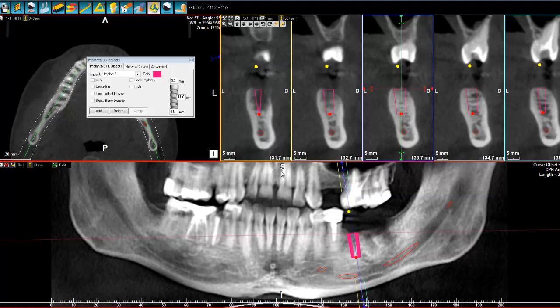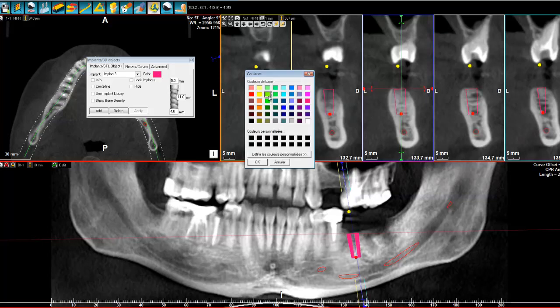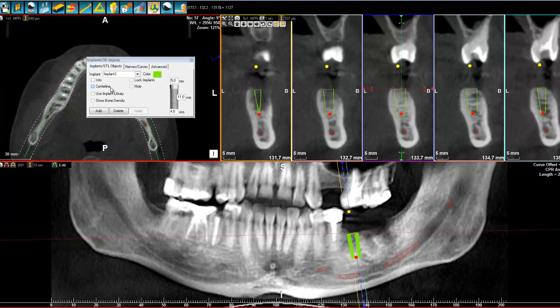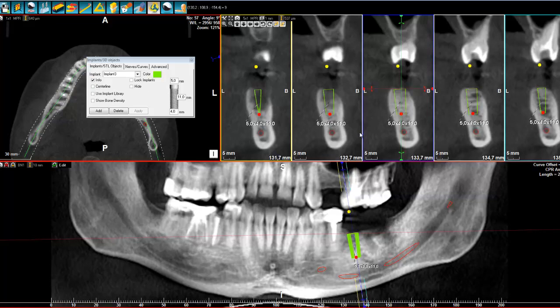Let's say my position is right. I can simply check that I'm not touching the nerve — which is good. I can, of course, change the color. As we had before, you can also change the name. We don't manufacture implants, of course. You can have the info, which is quite useful when we are going to print out the report. If you want to see the center line, especially when you put several implants together, you want to see there is no offset in angle between one implant and another. Once you're done, you can simply lock it — that means I cannot change the angle, which is especially useful when placing several implants.